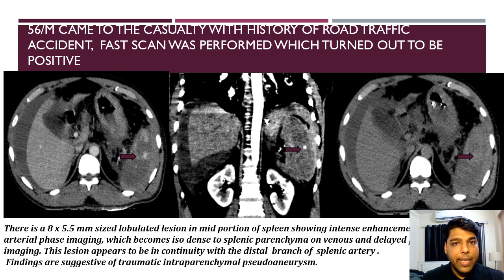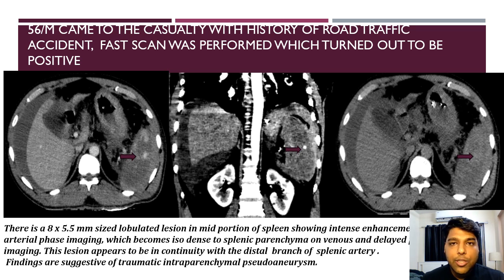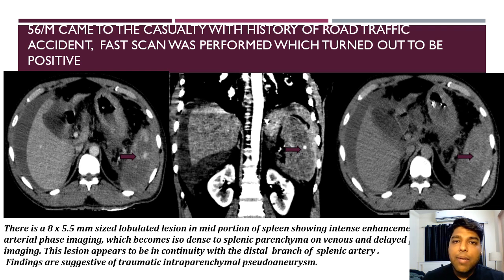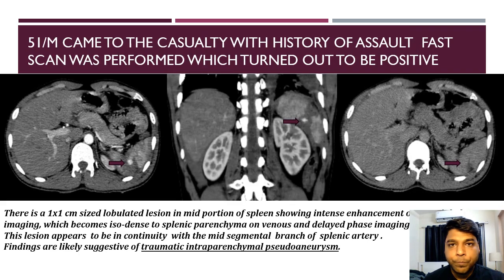Case 3: A 56-year-old male came to casualty with history of road traffic accident. FAST scan was performed which turned out to be positive. There is an 8x5 mm sized lobulated lesion noted in the mid portion of the spleen, showing intense enhancement on arterial phase imaging. It tends to appear isodense to the splenic parenchyma on delayed phase imaging. The lesion appears to be in continuity with a distal branch of the splenic artery, findings likely suggestive of traumatic intra-parenchymal pseudoaneurysm.